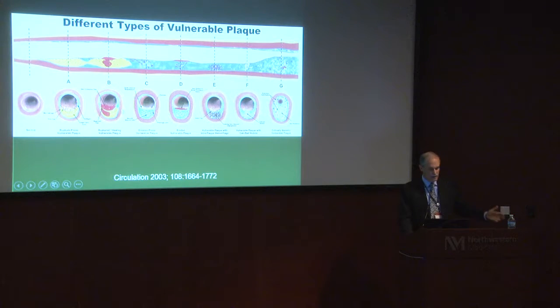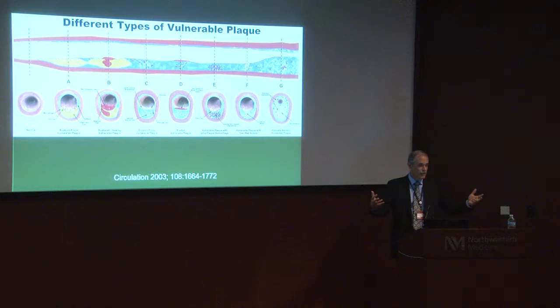identify that researchers have shown us, and that is early in the stage is a lipid-rich necrotic core. And the best way to explain this is basically a pocket of pus sitting in the wall of the carotid artery. And we can see it like we see pockets of pus anywhere else, as a non-enhancing area with an enhancing rim around it on a T1 weighted image. If we don't get that lipid out of the plaque, we don't delipidate it, it continues to be there. Activated macrophages continue to come in, neovascularity continues to come in, those vessels are very friable, they leak, and you get intraplaque hemorrhage.